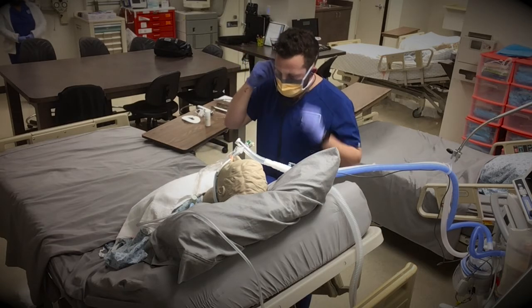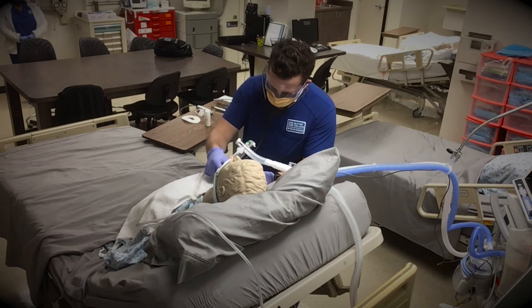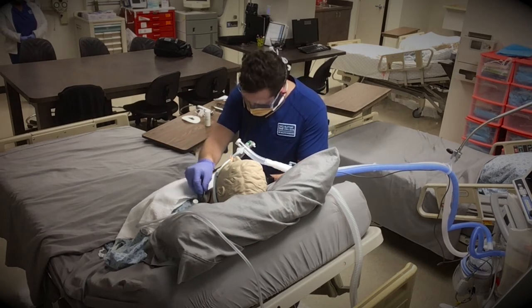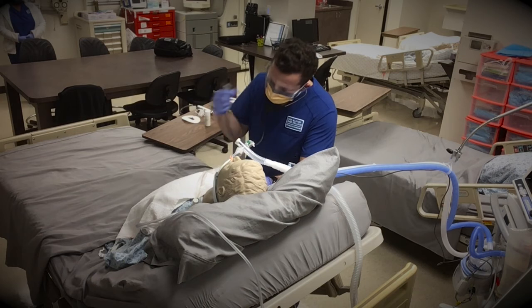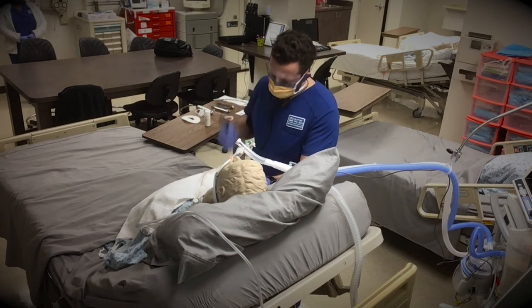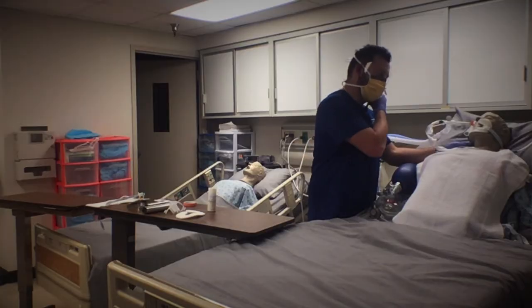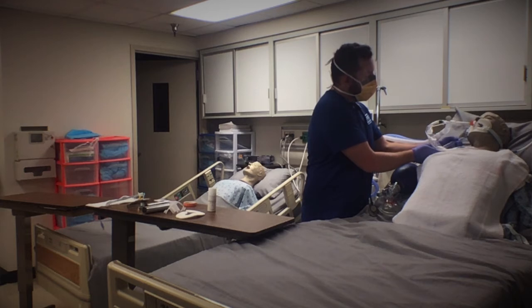Performing my cuff leak test. Alright. And now I put the air back in.